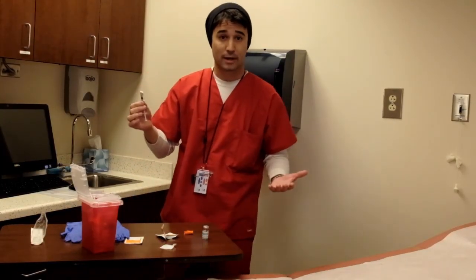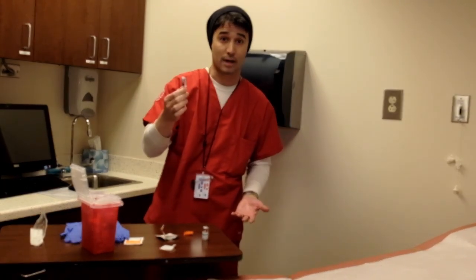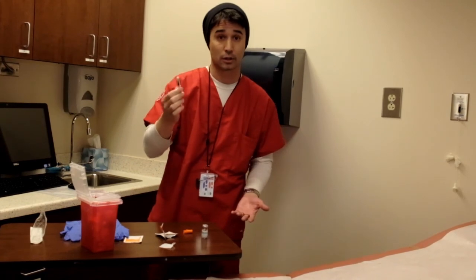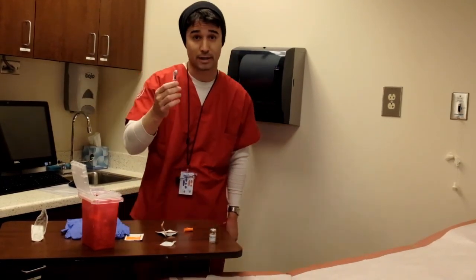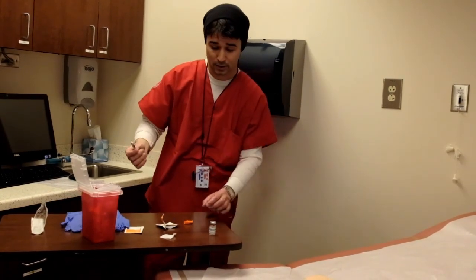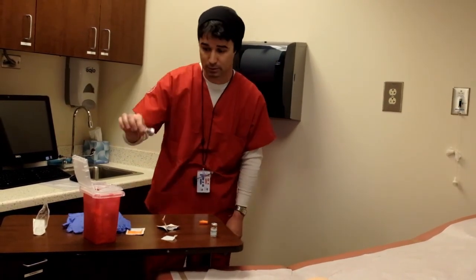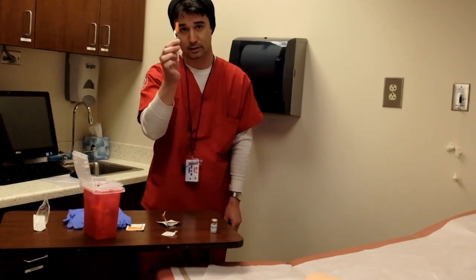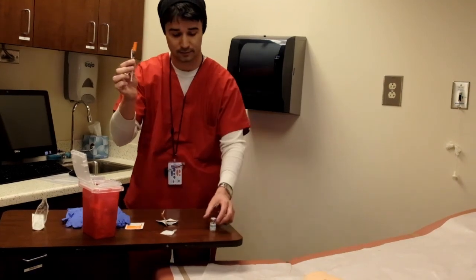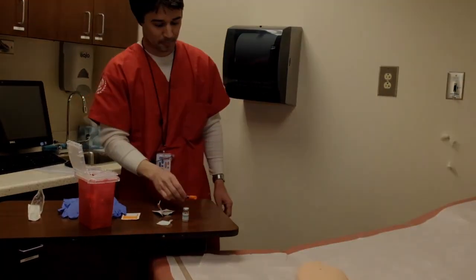Now, we need to find a way to get this medication to the client's room. We don't want to be running around a hallway with a sharp needle. So we're going to cap this needle on the syringe. The easiest way to do that is the scoop method. We just put the cap down flat on top of a surface, then scoop the needle into the cap. Nice and safe. And from there, we'll go into the patient's room.